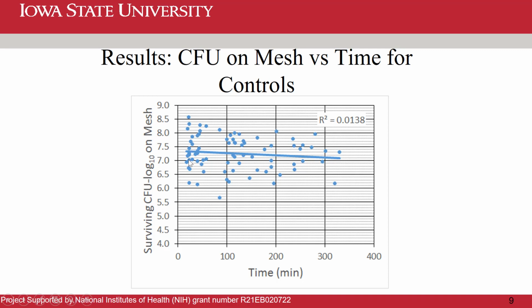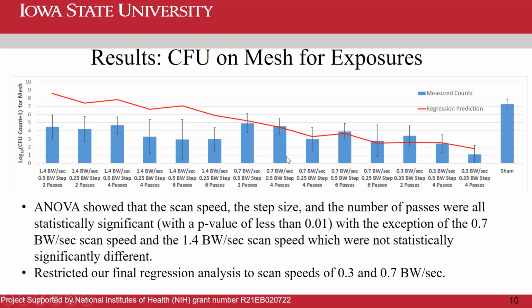tank. And so here we have the surviving colony forming units on the mesh as a function of time, spanning the entire range of times that we considered in our experiments. And we can see that there's no impact of time. And so we aren't introducing an artifact by having such large treatment times in our experiment. Now here are the results from each of the meshes.